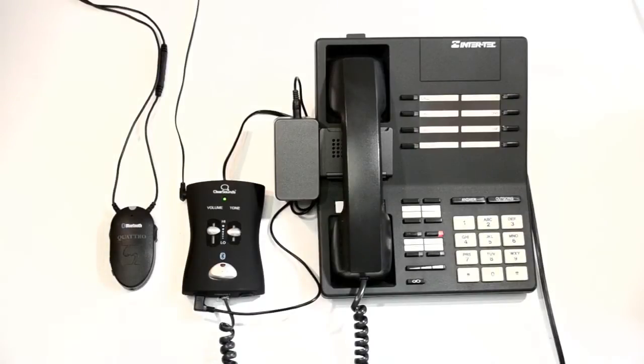The first time that you use the QH2 system, you must pair the hub with the Bluetooth headset streamer or neckloop that you will wear while using the system. For this tutorial, we will be pairing the QH2 hub with the popular ClearSounds Quattro neckloop. If necessary, consult your Bluetooth listening device's user guide to locate its multifunction button for pairing and to identify its pairing indicators.